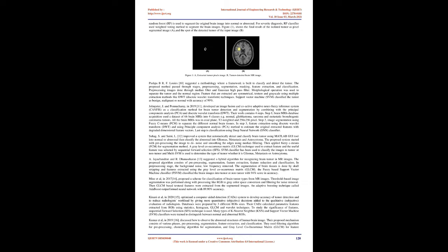Sophisticated imaging techniques can pinpoint brain lesions. Magnetic resonance imaging, MRI, and computed tomography, CT or CAT scan, are diagnostic tools. Magnetic resonance spectroscopy, MRS, is used for examining the nature of the tumor observed on the MRI and to analyze the tumor's chemical profile. To recognize recurring brain lesions, positron emission tomography, PET, is used. Sometimes, the neurosurgeon uses a biopsy to make a certain diagnosis of a brain tumor, and the pathologist decides the final determination whether a tumor is benign or malignant and grades it accordingly.